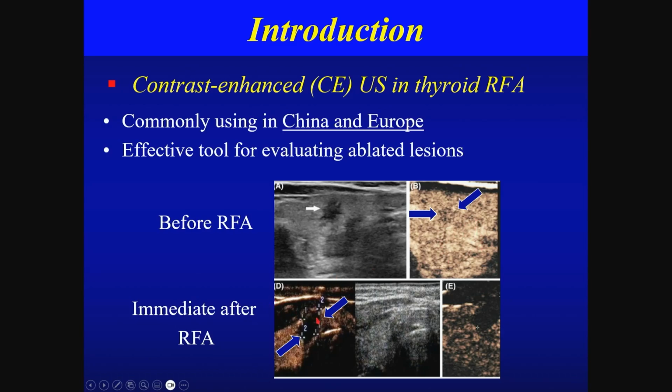Immediately after RF ablation, the microcarcinoma shows no enhancement during CEUS. So they proposed CEUS is an effective tool for evaluating thyroid ablated lesions.